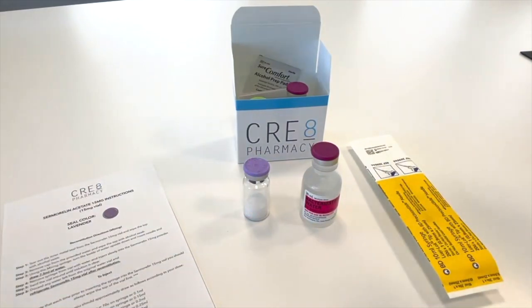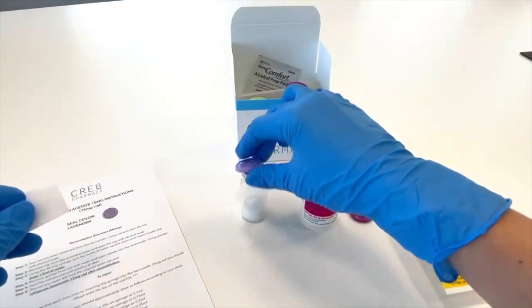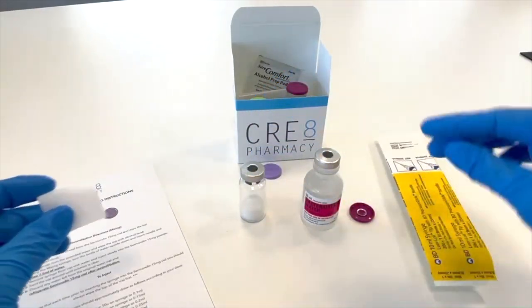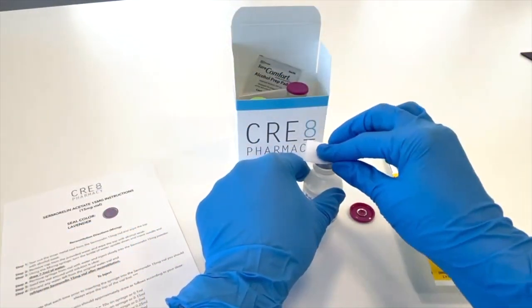Step one of the reconstitution process is to remove the caps of both vials. The second step is to clean the top of both vials in a backwards-forwards motion.